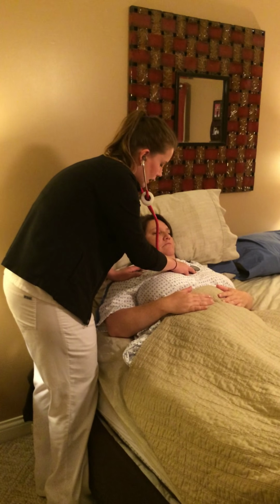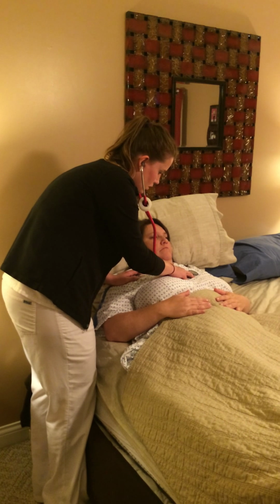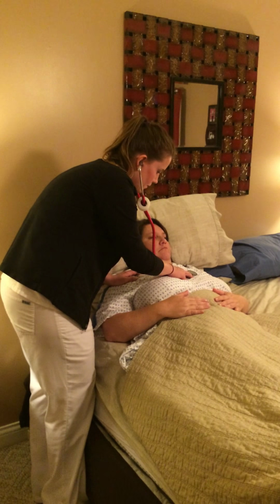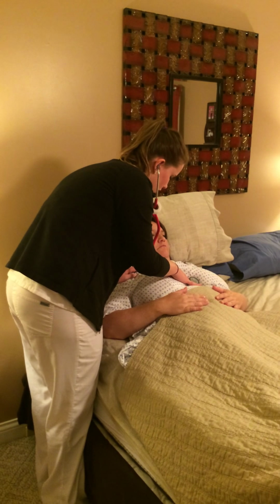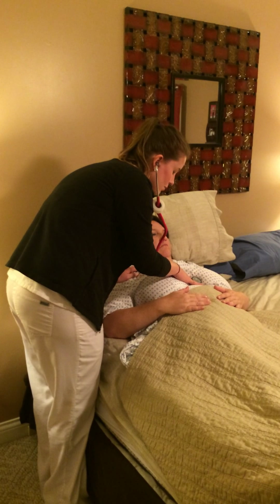This is the second pulmonic area. The fourth and fifth. This is the tricuspid area.